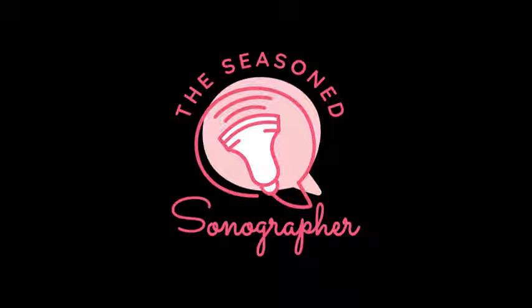The cavum septum pellucidum in the brain is essential for viewing because it is part of the midline brain structure that's visualized when you're looking at the biparietal diameter, or the BPD. You see the thalamus and the cavum septum pellucidum. The cavum septum pellucidum is identified by 2 little tiny white lines on either side of that midline falx. It creates like a little box, and it's anechoic, and it contains fluid. You can also see in the fetal brain the midline falx. It confirms brain symmetry, and it's the white line running from the front to the posterior aspect of the fetal brain, and should always be seen when you're doing the biparietal diameter.